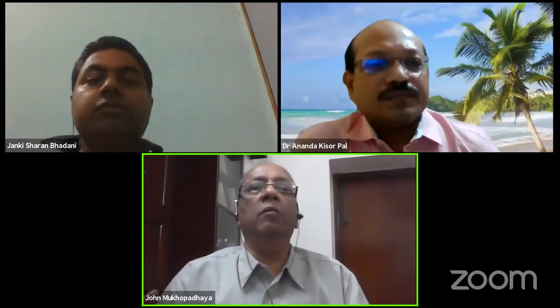So essentially, you need to check the stump, the prosthesis, and the fitting. Exactly. All three parts you need to check separately: whether the prosthesis is broken or worn out in one part or in good condition. Then check the stump for any problem. And then check the fitting of the socket with the stump, so that it is a nice fit, with no undue motion between the two.